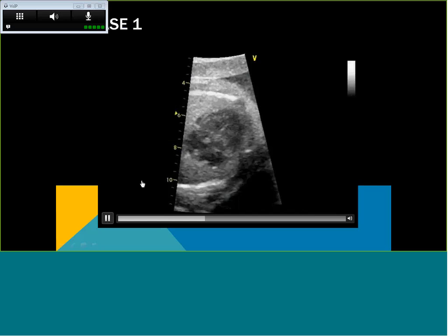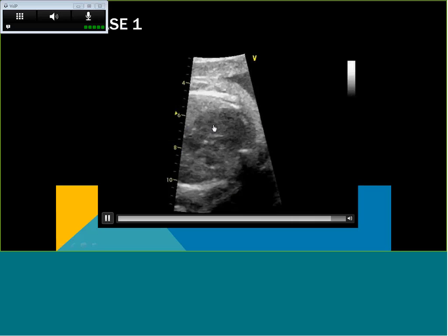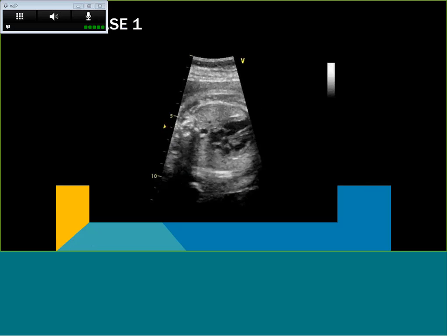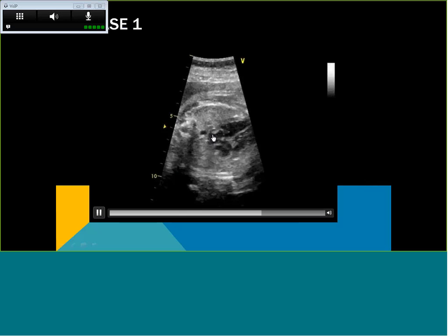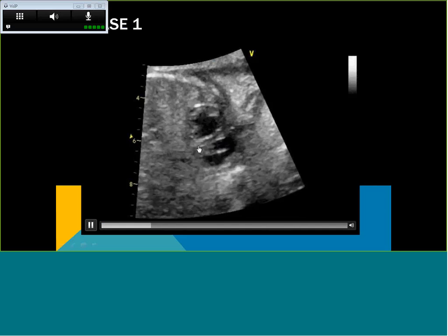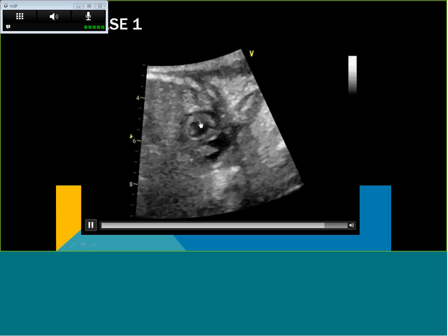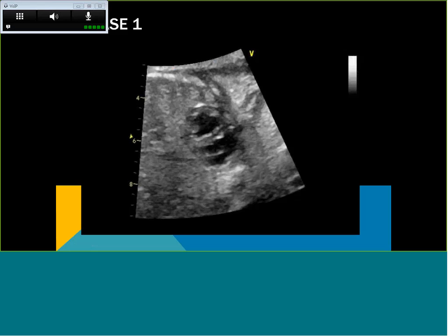This is our 4-chamber view, posterior, anterior. I'm going to say this is left ventricle, right ventricle here. And there certainly doesn't look like there's any prominent size discrepancy. In terms of the foramen ovale, it looks right to left. Function looks normal. In the short axis view, again, this looks pretty normal. Here's our left ventricle, our right ventricle. There's a little bit of that discrepancy that we had talked about previously, but nothing that really stands out as being tremendously abnormal.